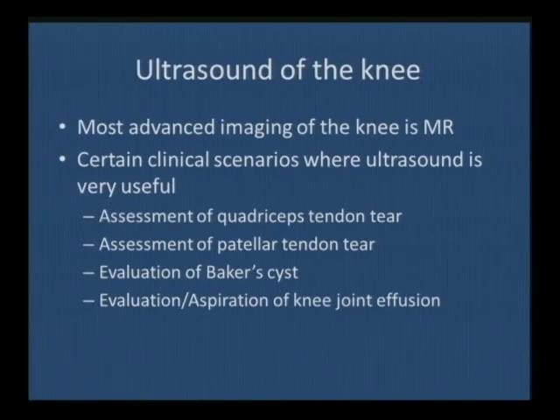If we look at ultrasound of the knee, most advanced imaging of the knee is MR, and that's fine.